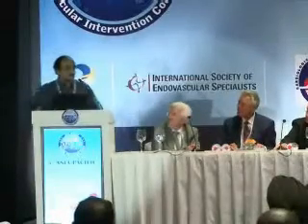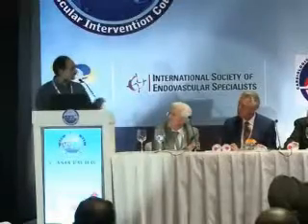How do you keep the graft sterile for that period of time? Yeah, we have these long sterile covers which we use for ultrasound procedures, the sleeves. Put it inside the sleeve, seal it, and we keep it on a sterile table and cover it with a sterile drape. But it's just overnight, maybe 12 hours.